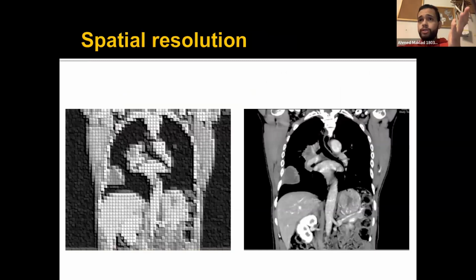Now for spatial resolution, as I mentioned yesterday, those are pixels. The smaller your pixels are, the more pixels you have, the better the spatial resolution, all right? I go in depth about this in yesterday's lecture if you want to go and watch it on the YouTube channel.